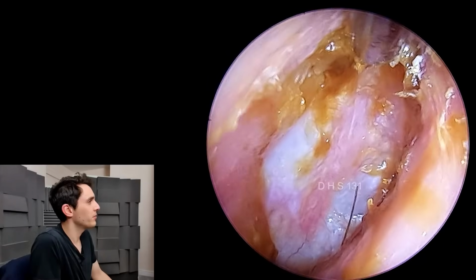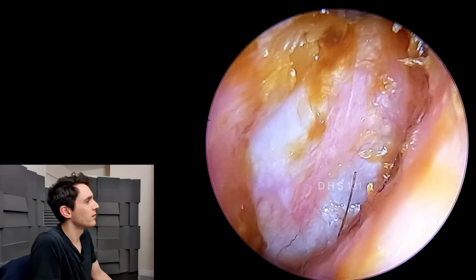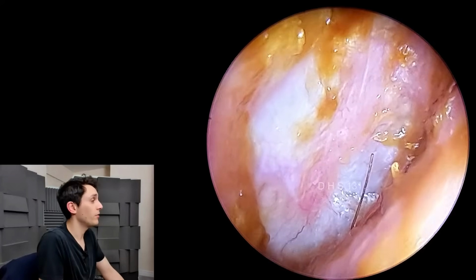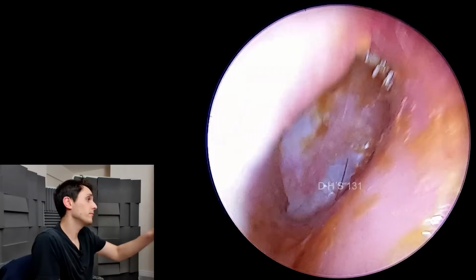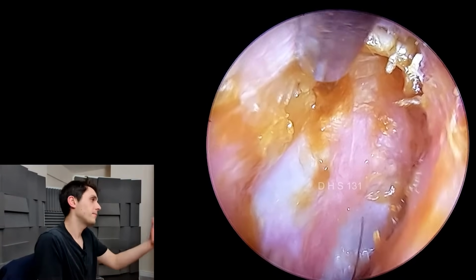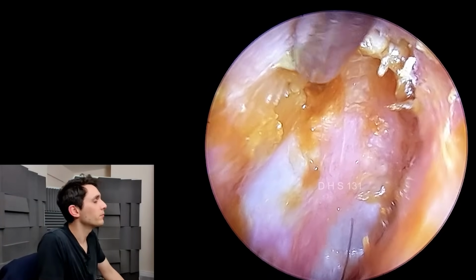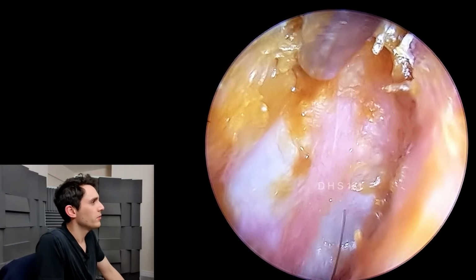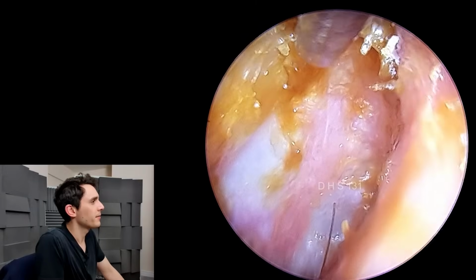And again, just peeling this dead skin here at the top, but we're nearing the end of the procedure now because the patient is getting a little bit jittery. And again, there's no anesthetic here, so we're really relying on the patient's goodwill, but fairly nice looking eardrum, I have to say. Again, there's inflammation there, but all things considered, it looks quite nice.